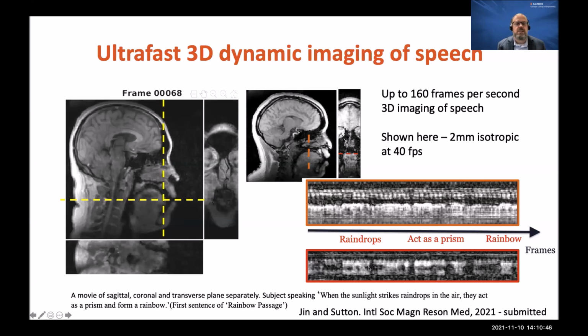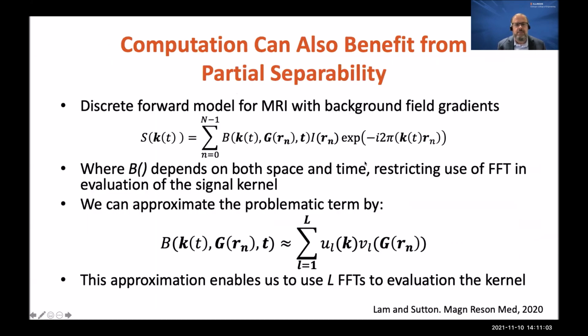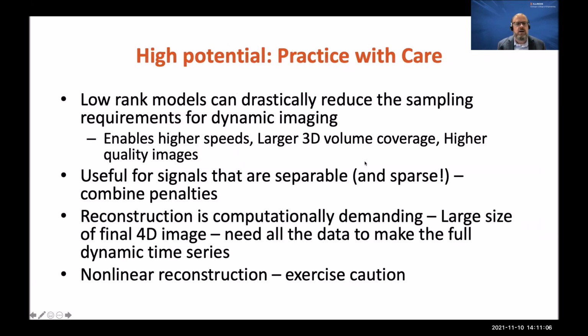We're actually using this in a study to look at cleft palate individuals and to see how, when surgical repair of different muscles in this region happens, if we restore motions that are more similar to healthy control subjects. This really allows us to see 3-dimensionally what's going on here, whereas there's no other way we could have sampled that. Let me just go back to this.